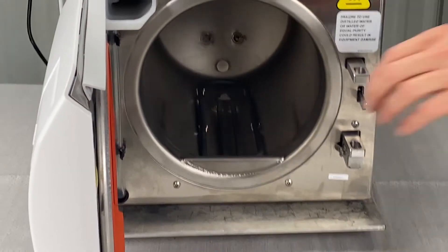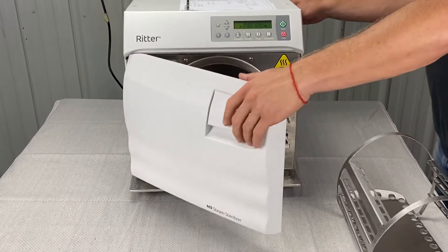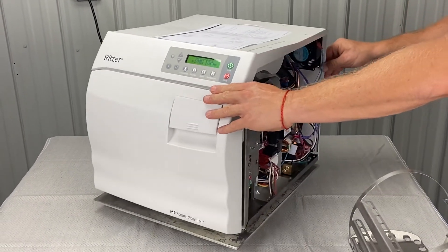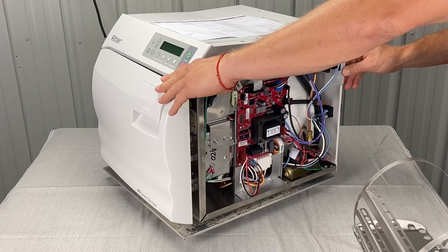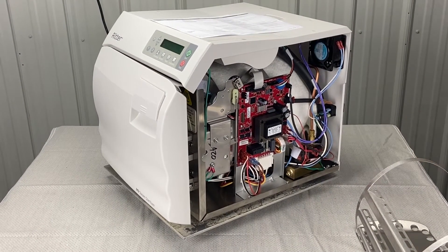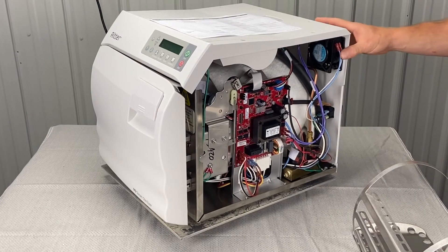Cleaning the filters is also part of your monthly maintenance. You can also run a speed clean cycle — it's a cleaner for the chamber, the filters, and the valves. We sell that on our website, statofusa.com.